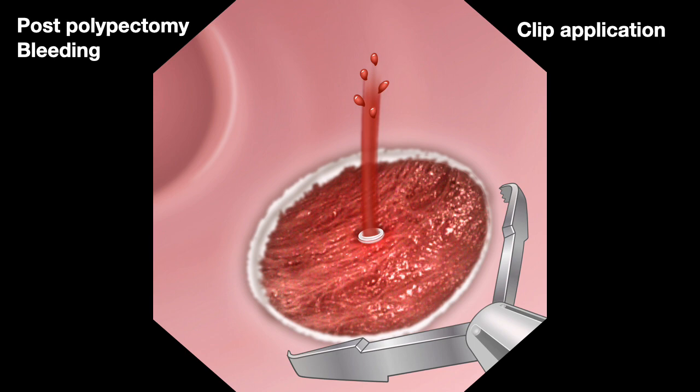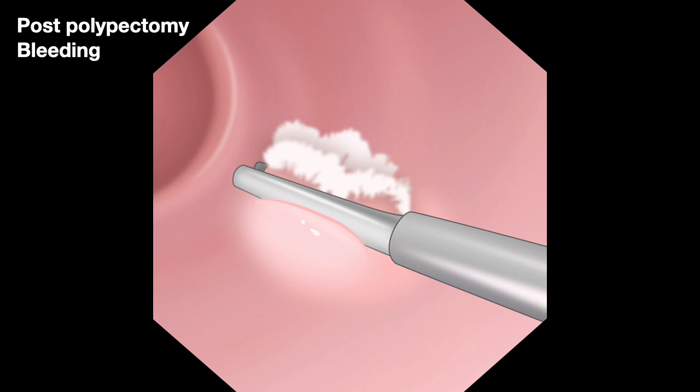Make sure that the bleeding has certainly stopped before you ask your assistant to deploy the clip. If you do not follow this protocol and you apply the clip and deploy without confirming that you have stopped the bleeding, then you have wasted that real estate there and you may be applying a bunch more clips to secure that vessel. So when applying a clip, follow this protocol.